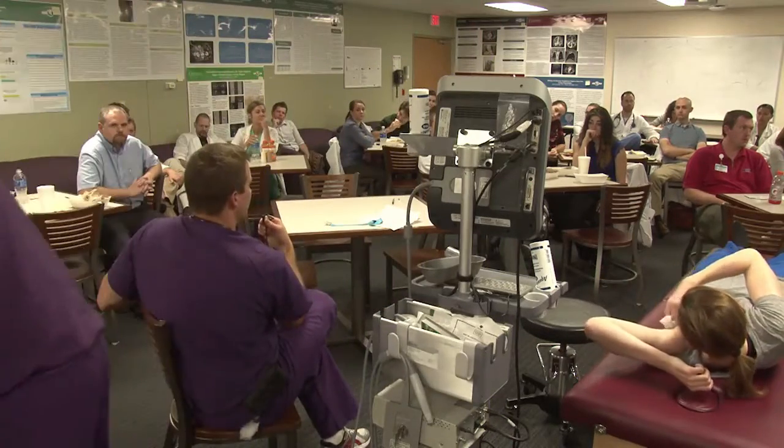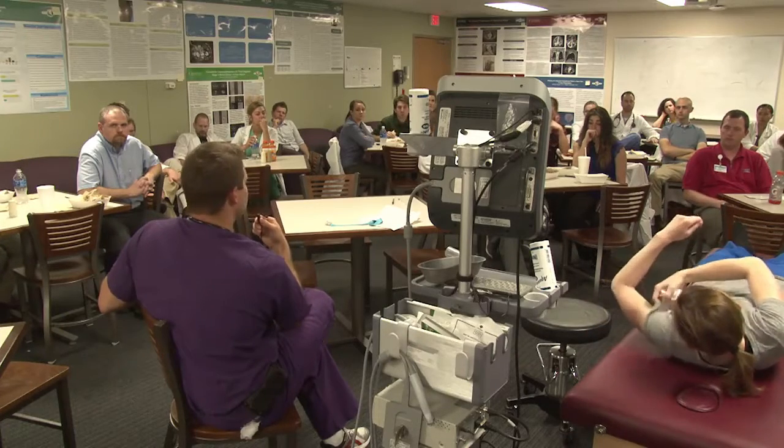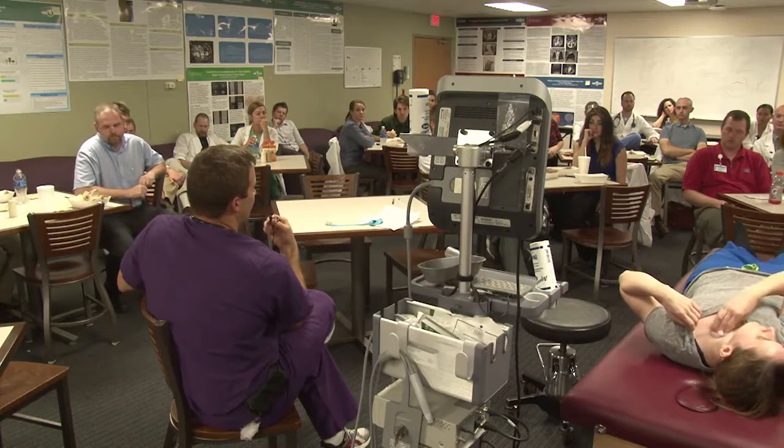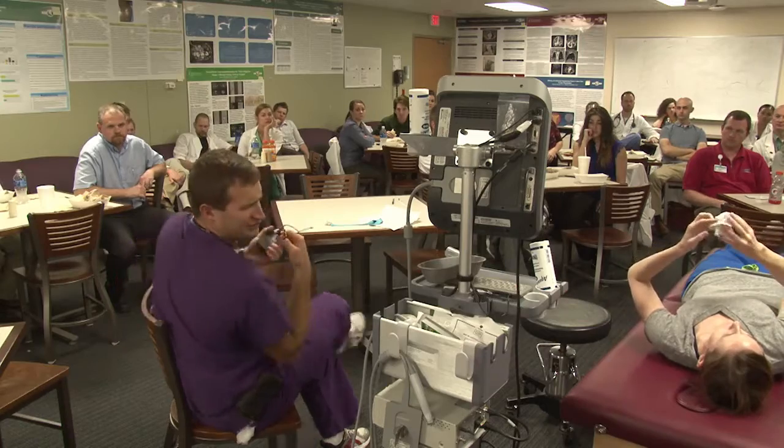A lot of it has to do with you have to know your anatomy very, very well. You still have to know your anatomy when you're doing ultrasound guided blocks, of course. But it was a combination of knowing your anatomy, and we also use nerve stimulating needles. Do we have one in here?